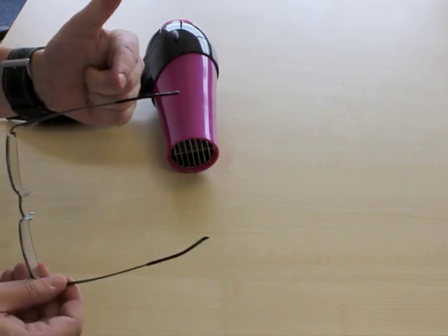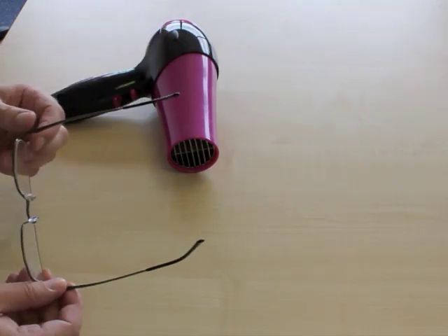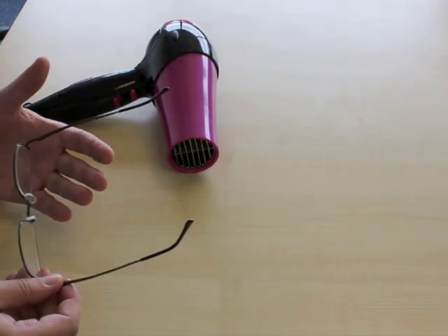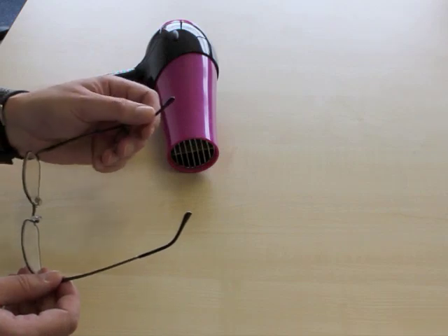Apply heat just to the bend part. Normally this will take about 20 to 30 seconds — make sure that it's still okay for you to touch. You don't want to burn your hands. The temperature you're looking for is a hot cup of tea.